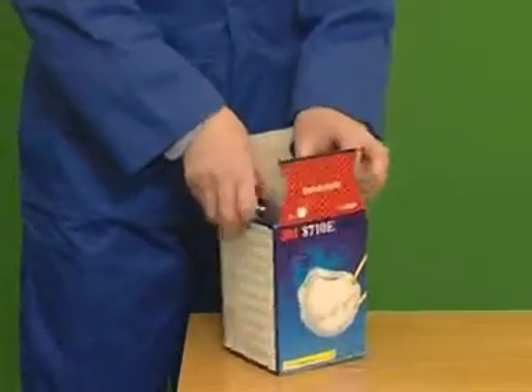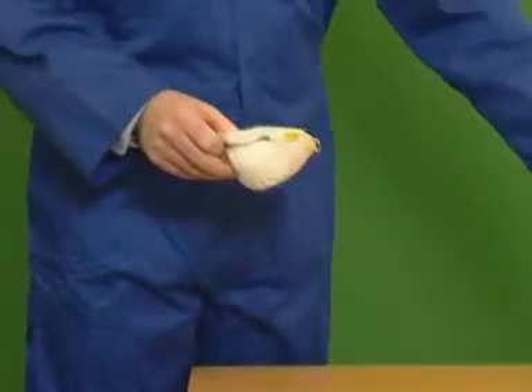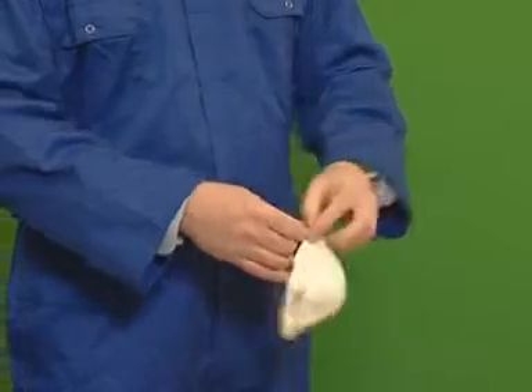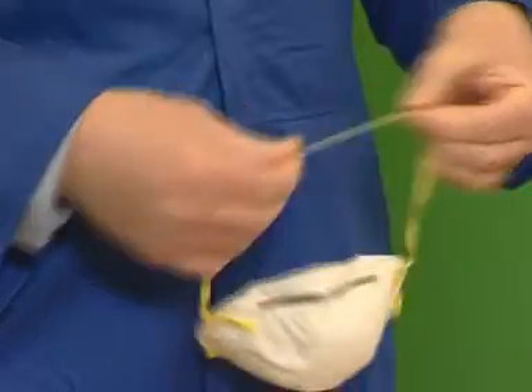Remove the respirator from its box. Pre-stretch the straps by stretching them approximately every five centimeters along their length.